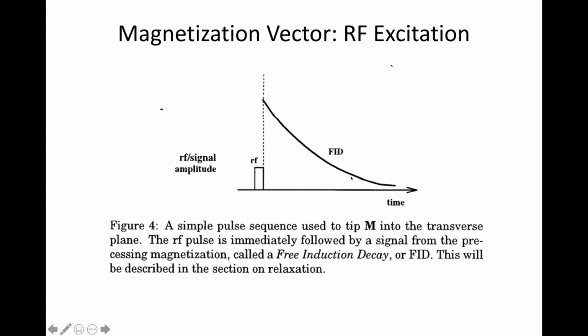This FID, it's called the free induction decay, is the envelope of the amplitude of that signal. So inside this envelope, we would have a 64 megahertz oscillation occurring and diminishing in time, okay? In the rotating frame, instead of seeing this oscillating 64 megahertz sine wave with this envelope, we would just see this component, right? That's after transforming to the rotating frame, or the 64 megahertz frame.